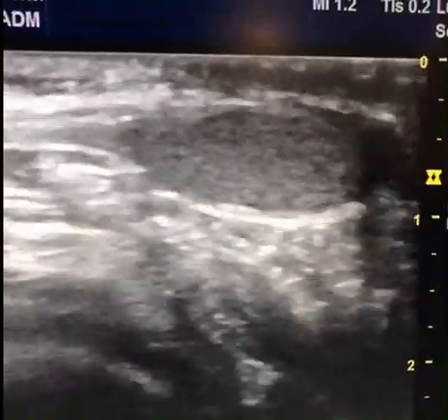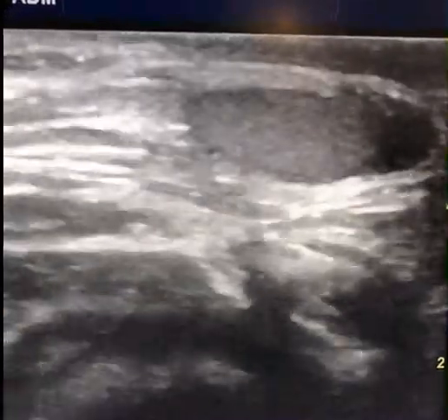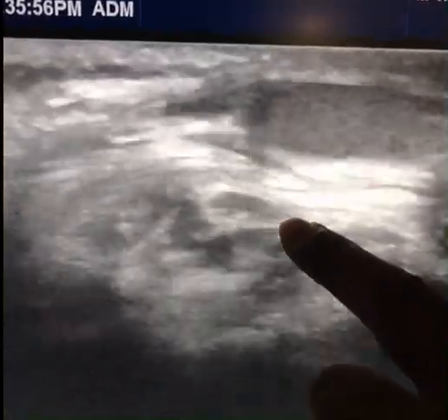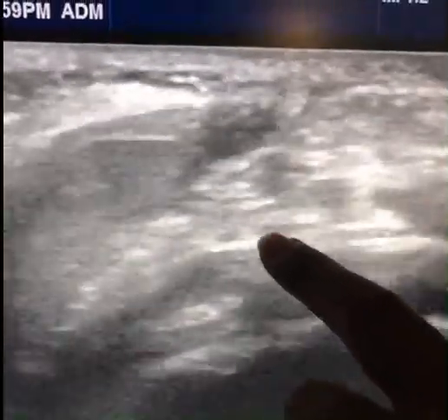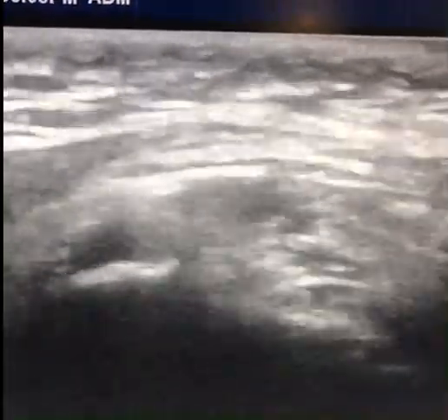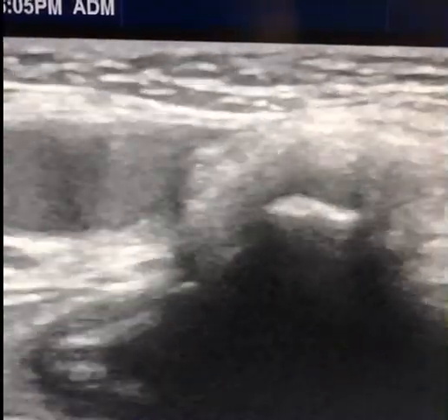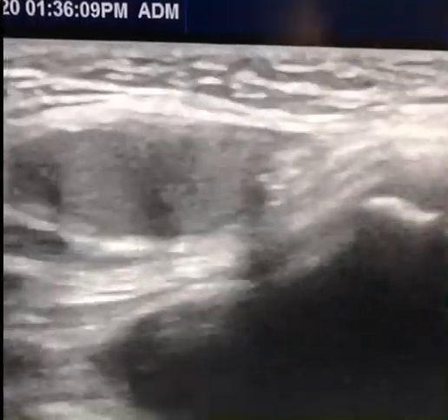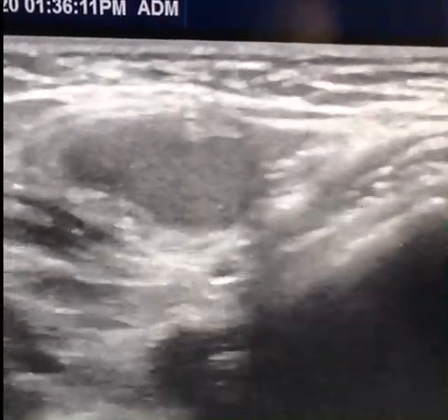I'm going to push it. There it goes. Okay, pushing. I'm not pushing a lot of pressure, just slight pressure. And here it again enters the inguinal canal. So this is how a retractile testis is. That's it. Thank you.